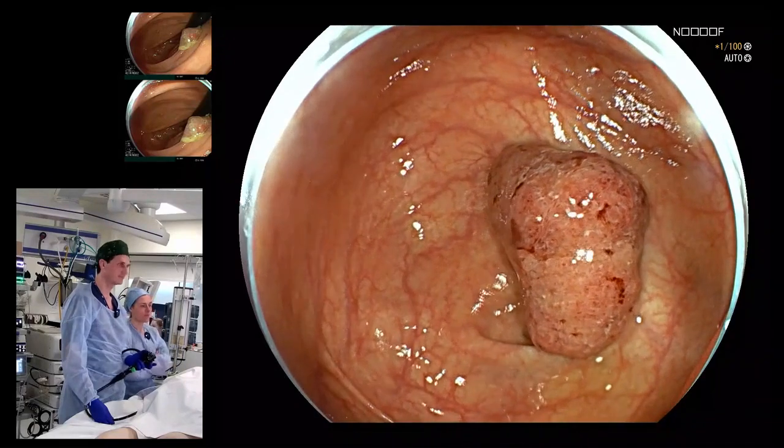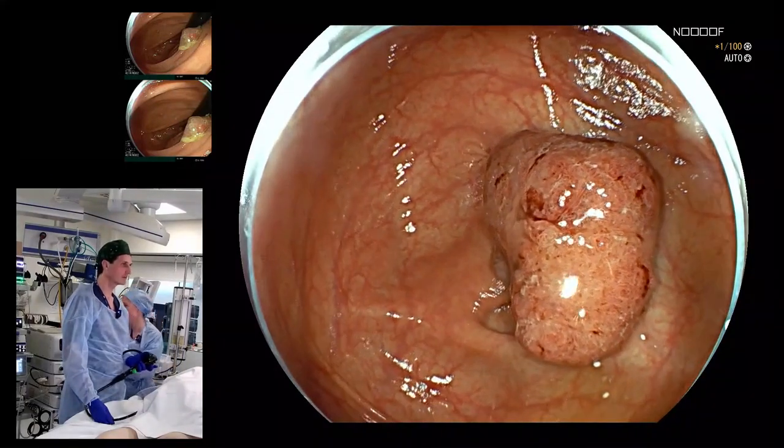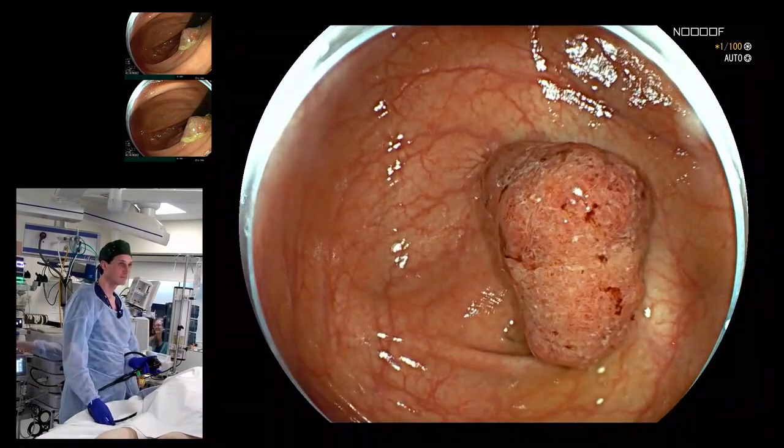So you obviously already have a lesion. Maybe you want to turn off the AI. I don't know if the AI is on or not, but if it's off, it's off. That's good. Maybe it's Zoom I'm seeing that's on. So we now have, what endoscope have you got? It looks like Fujifilm. Is that right?